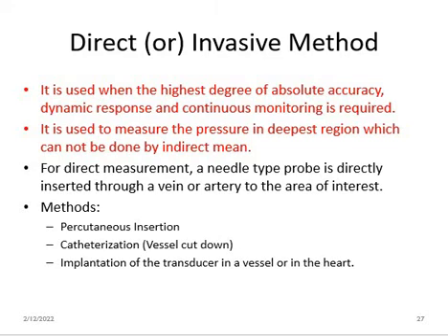Also, to measure the degree of accuracy, in the sense whether his heart is performing correctly, with equal interval and rhythmic value, proper amplitude, everything. So to measure these things, we need a continuous and accurate value, and a deep region, into the heart.